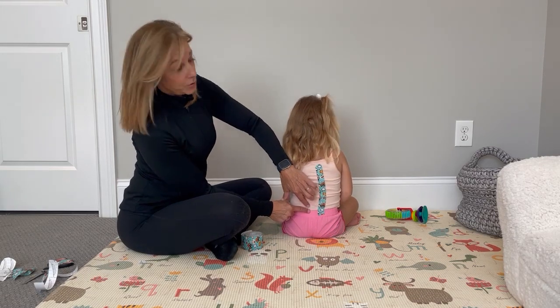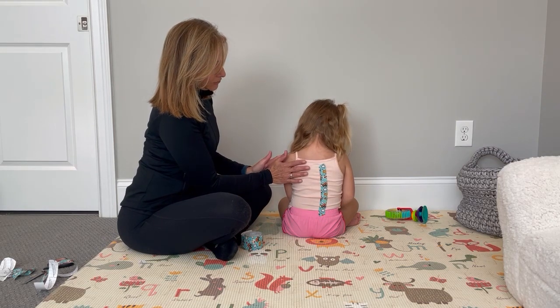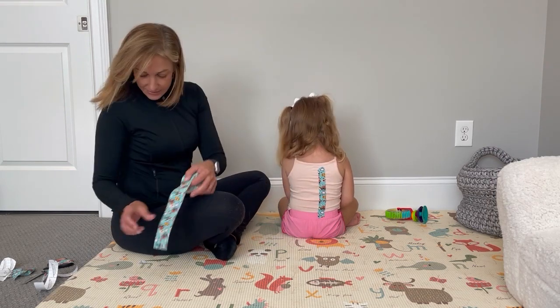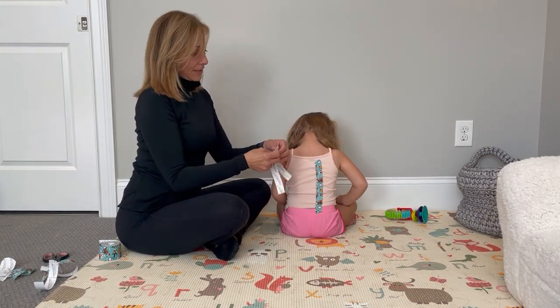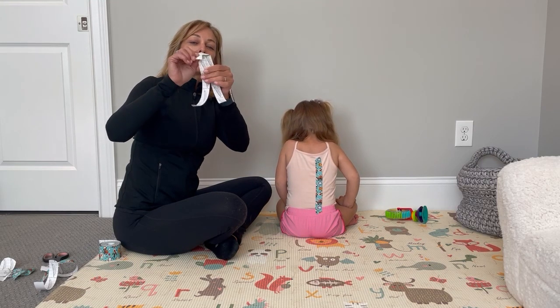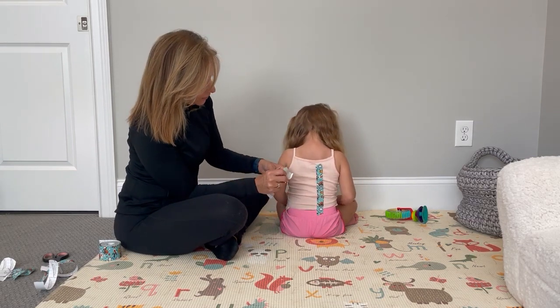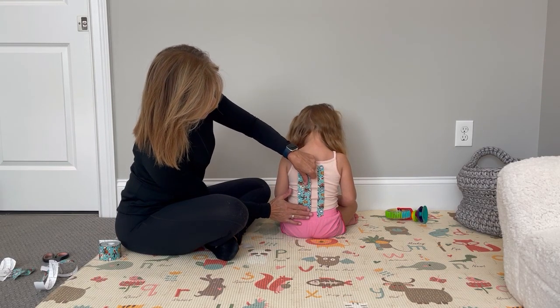So I'm going to show you how to do a piece that's a Y strip. Now, a Y strip is going to be able to grab her shoulder blade a little bit and also cover a wider area. So you're going to, again, measure the tape, out of your hair because I don't want your hair to get in it. And the same thing, you would have the child sit as tall as possible. You're going to rip the tape right above the tails. You want to make sure both tails are free so that when I put the anchor down, it's going to go below the area that's weak. So we're going to go down here as a demonstration.